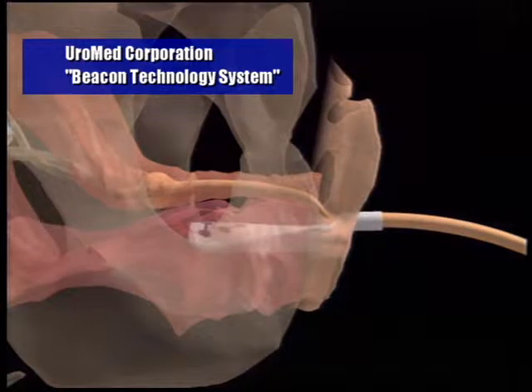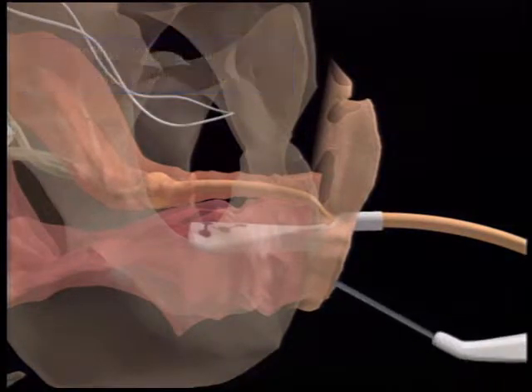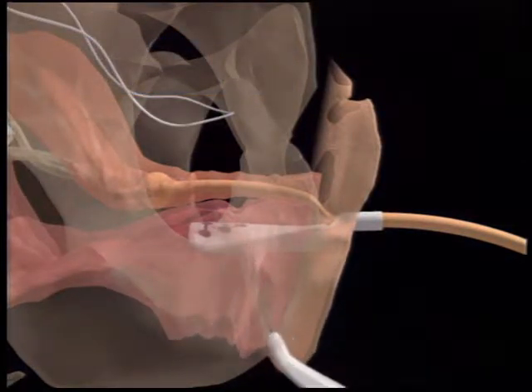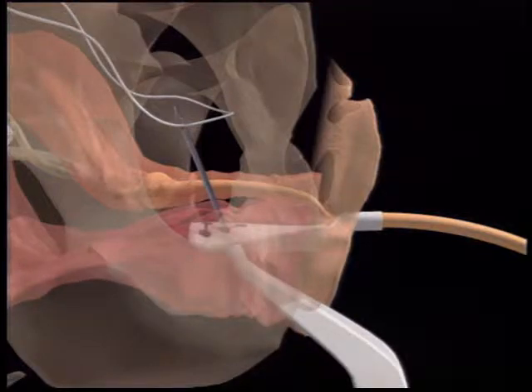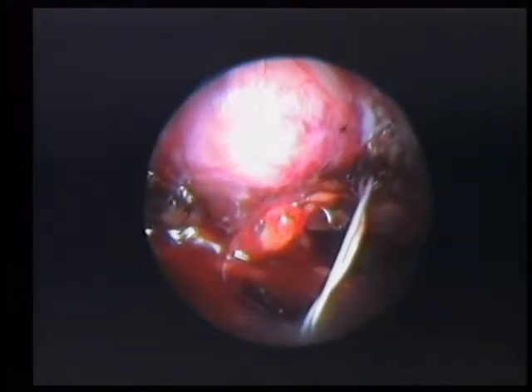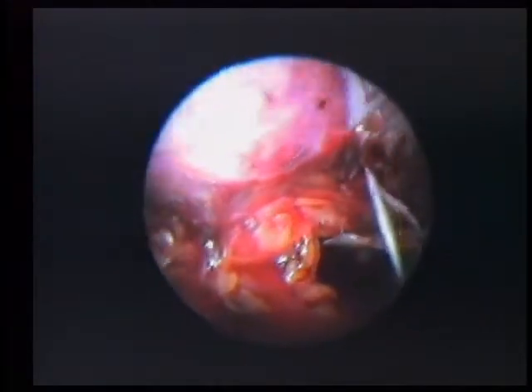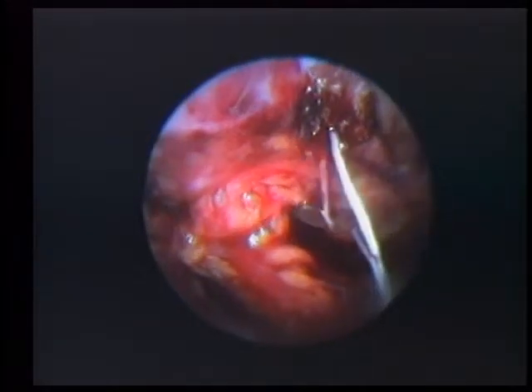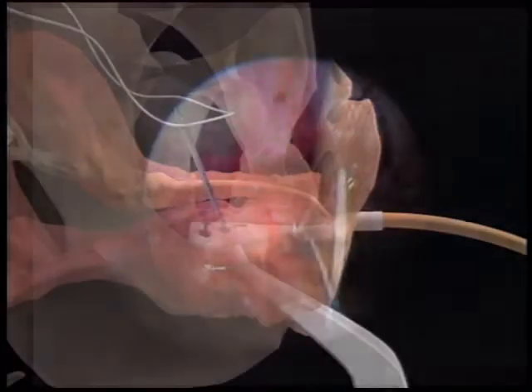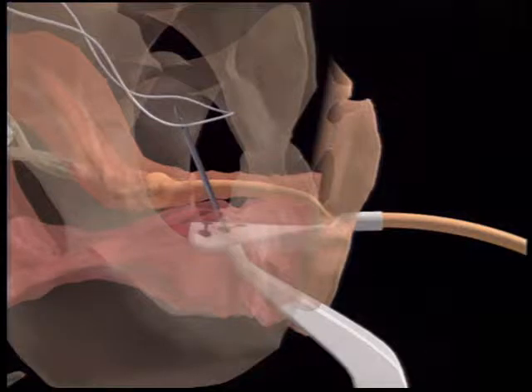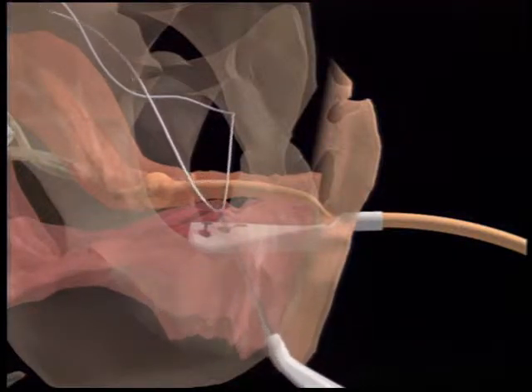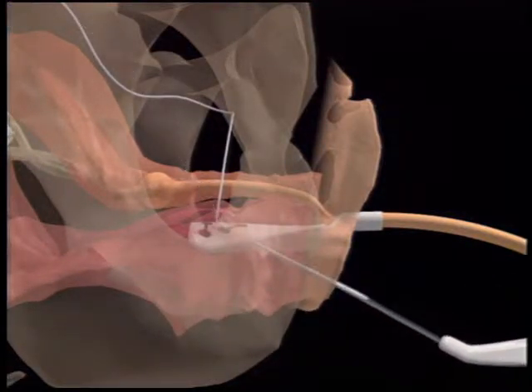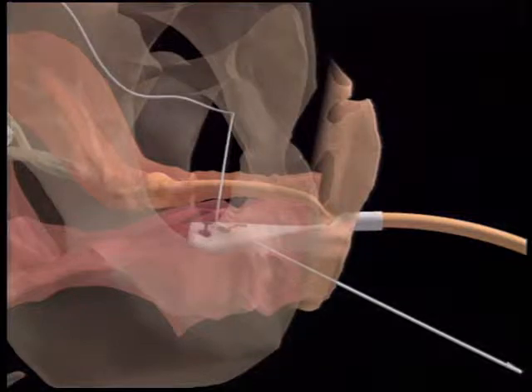With an upward motion, the periurethral fascia is penetrated and the retriever is advanced into the space of Retzius. The retriever captures a suture on the corresponding side of the guide. The notched end is used to ensnare the suture tails. With a downward motion, the retriever needle is withdrawn through the vaginal guide and secured outside the vagina with a hemostat.